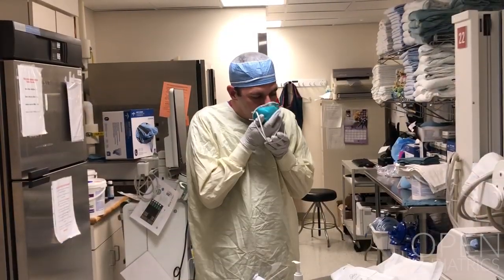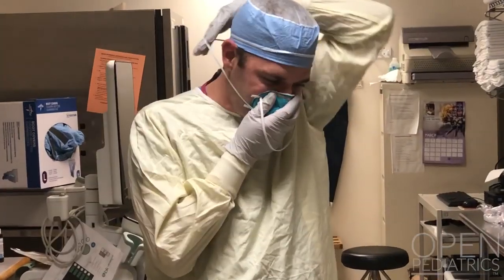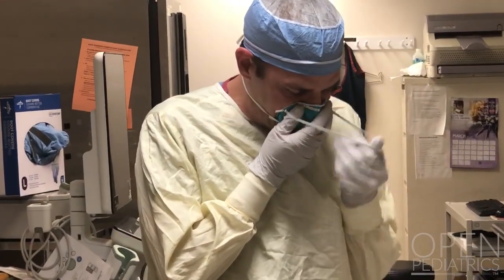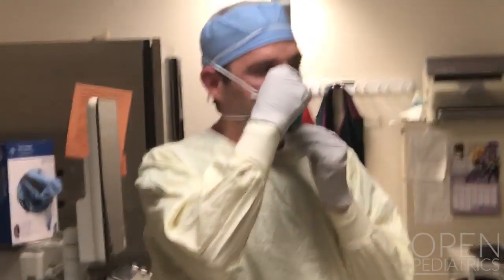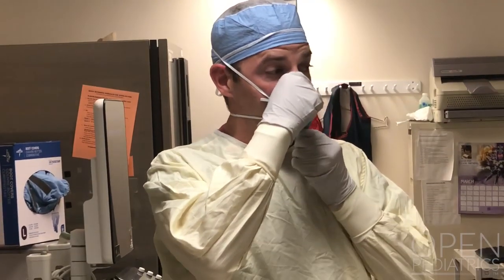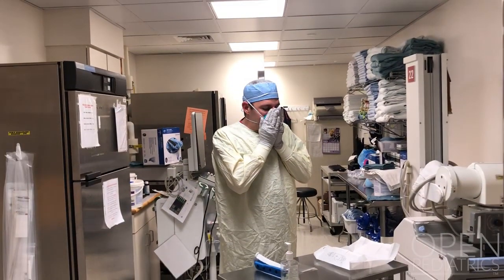Now fit the N95 respirator mask over your nose and mouth, putting the lower strap in the middle of your neck and the upper strap in the middle of your head. Fit the nose piece so it's snugly fit and make sure your chin is covered. Perform a quick fit test by placing your hands over the mask and taking a deep breath in and blowing out to see if there's any leak.